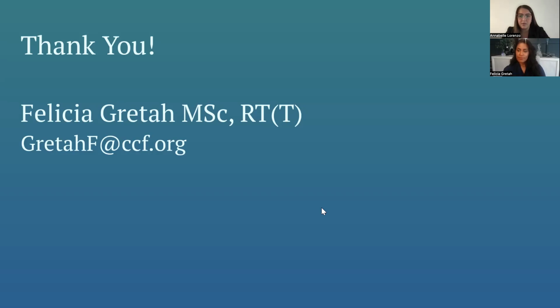Somebody is asking if there is a charge for billing for the SDX, maybe a special procedure charge. How do you do it at Cleveland Clinic? So we bill a respiratory motion management charge at the time of planning, and then the SDX is a complex charge during the simulation as a device. And if you want to have more details, you can also email Felicia directly to see how they're doing.